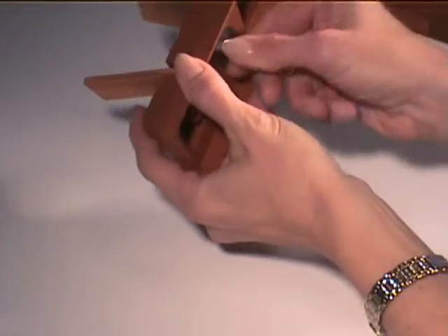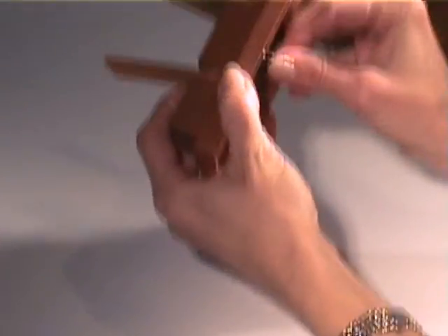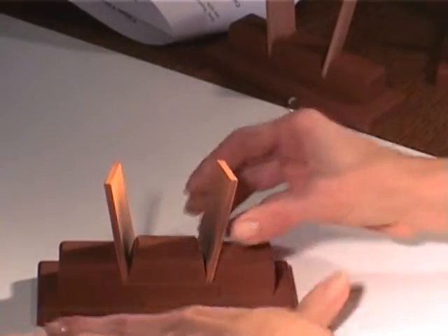Use the short push and pull stroke to move the tip up and down in the groove. To change Hones, loosen the thumb screw and push up on the screw until the center block snaps up. You can now remove the Hones and insert new ones.